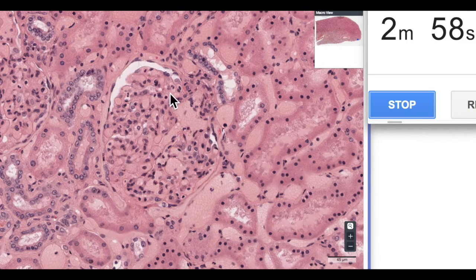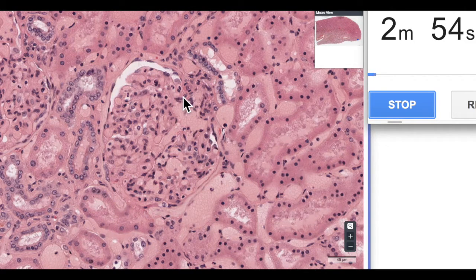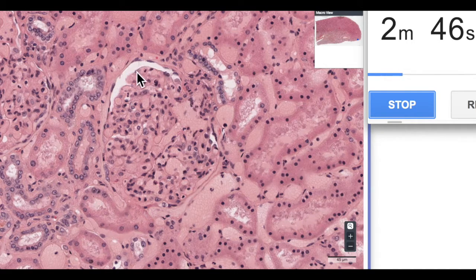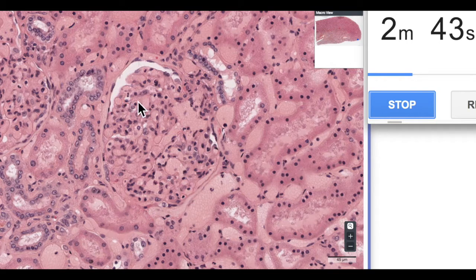So here's our renal corpuscle. This is obviously the kidney cortex, and remembering that the renal corpuscle is made up of the Bowman's capsule consisting of a parietal layer — which are these squamous cells — and then the visceral layer, which are the cells which sit on the surface of these capillary loops, which is the glomerulus, and these are the podocytes.